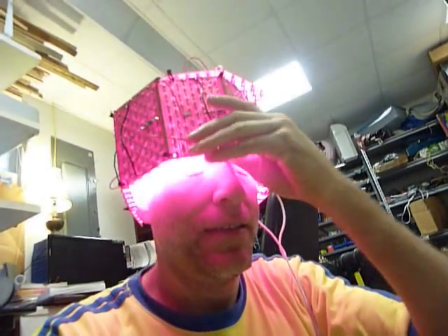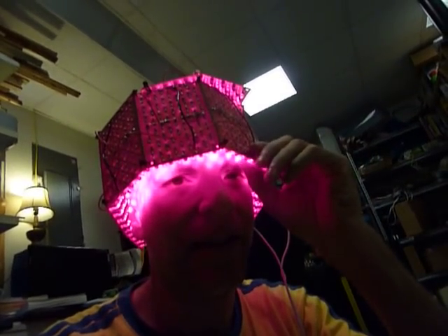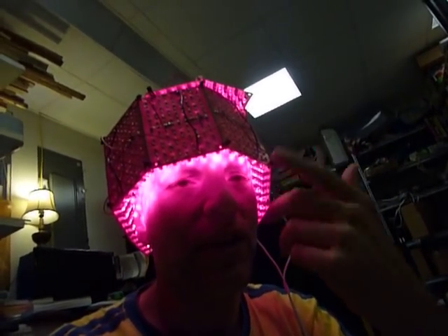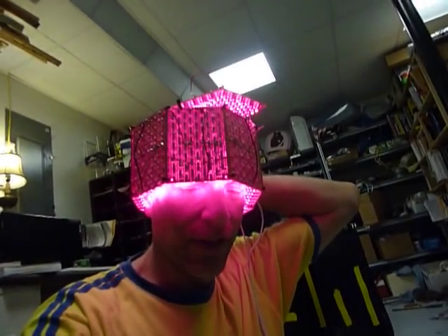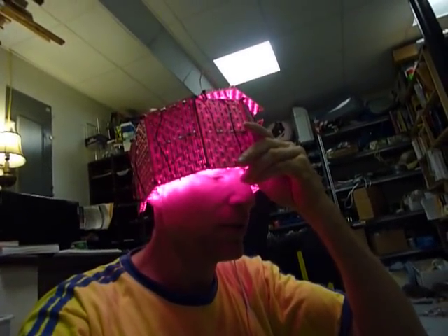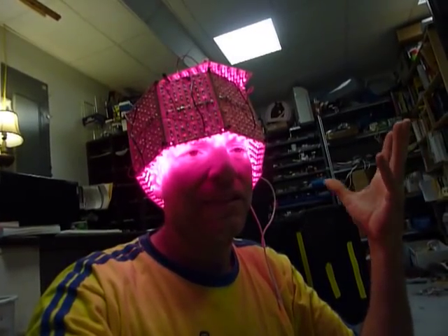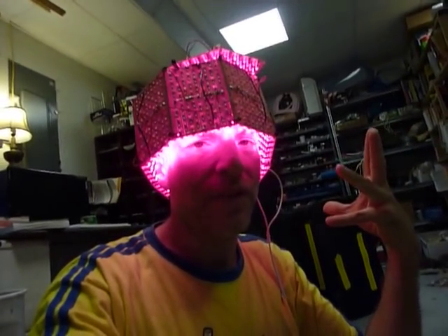I'll go ahead and put it on just to show you. I don't have much hair anyway. With the LEDs positioned above the eyes like this, it should be perfectly safe for the eyes. Even if they were shining directly into the eyes, I personally don't think it's very dangerous at all — technically maybe there should be some concern.